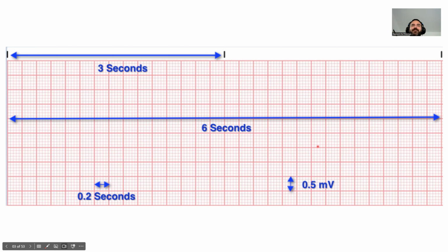Typically, for us entry-level nursing students who are just going in to get their RN, it's going to be pretty apparent, and I'll go over some examples as we go on to other rhythms. You're not going to need to memorize a certain voltage. It'll be like, okay, yeah, this is very clearly a PVC or something like that.